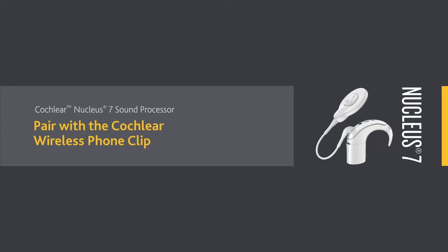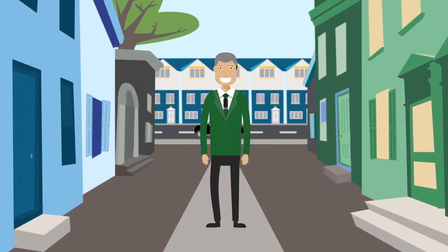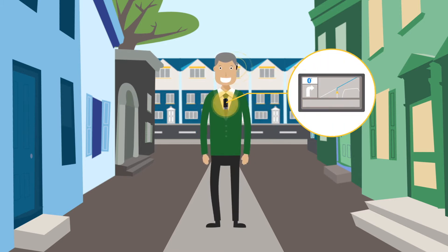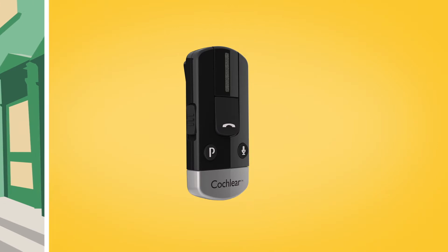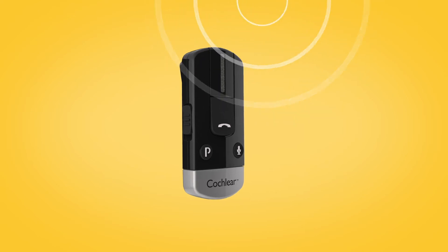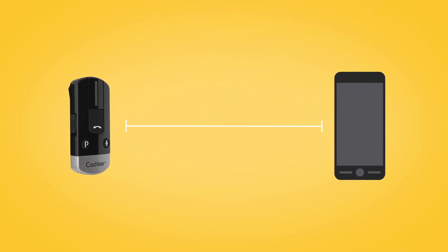The Cochlear Wireless Phone Clip can easily be attached to clothing, letting you enjoy hands-free calling direct to your sound processor, hear your Bluetooth-enabled navigation system, and stream music from a Bluetooth-enabled device. The built-in microphone will pick up and transmit your voice, so you can chat hands-free even if your phone is several metres away.